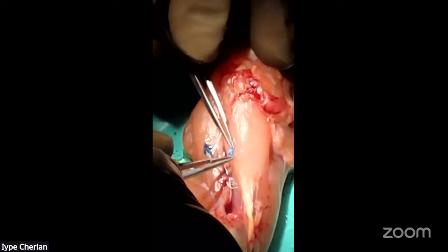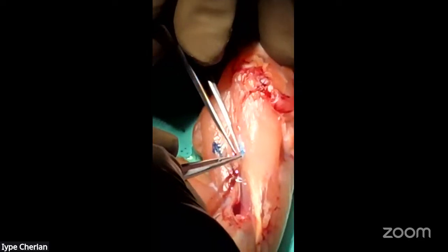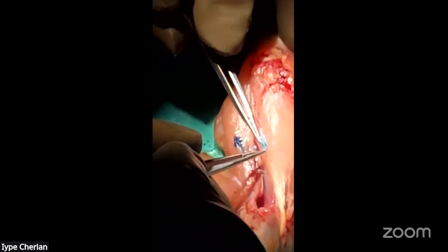You can see, John, it's unrestrained, which means the vessel is free.